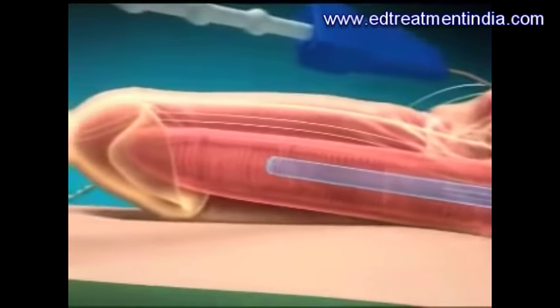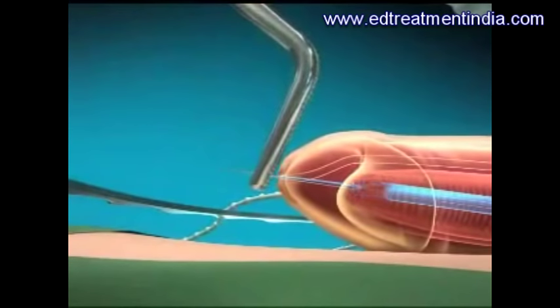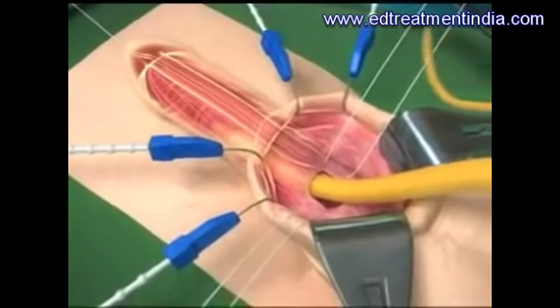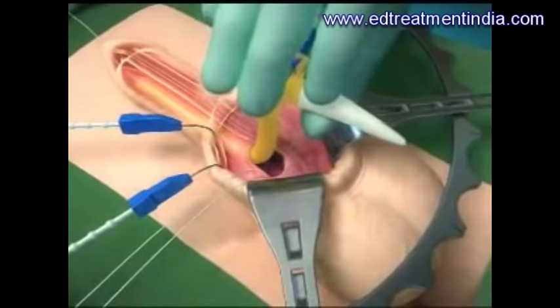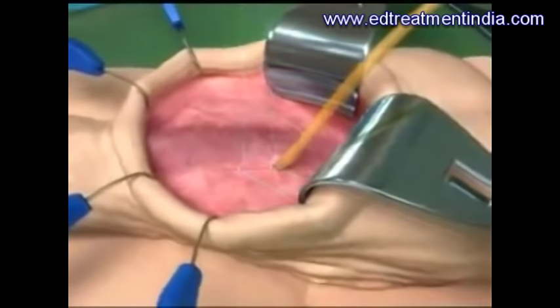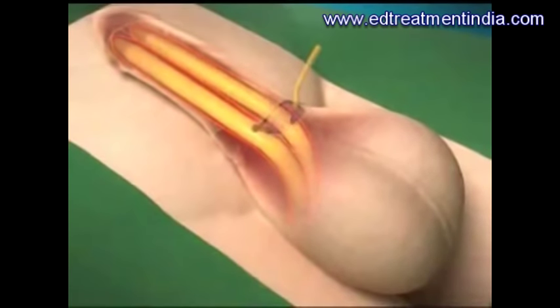A special inserter is used to draw the cylinder out into the shaft of the penis. An extender is applied to the proximal end which goes down into the pelvis. The sutures are tied to close the tissues over the cylinder and a second cylinder is placed in a similar manner.